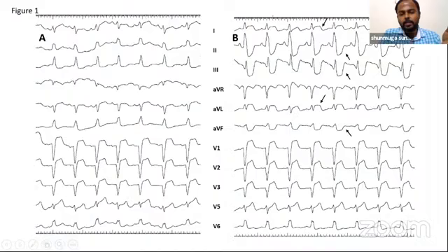So we had a case where the patient developed a transient ST elevation in lead 1 and aVL with a reciprocal ST depression in inferior leads. So what we thought was probably we could have crossed the septum. So we know that we have to place the lead just in the left ventricular subendocardium. If you are going to cross the subendocardium and expose the lead into the left ventricular cavity, there is a chance that a thrombus may catch here and it may embolize into the systemic circulation. So probably that might have happened in this case.